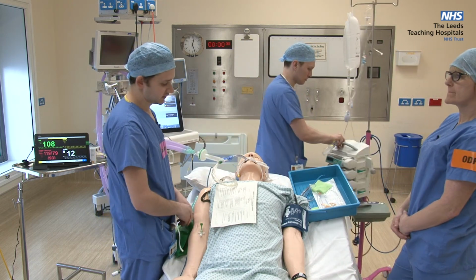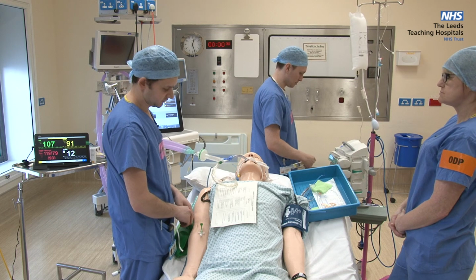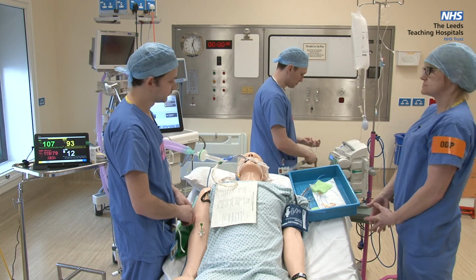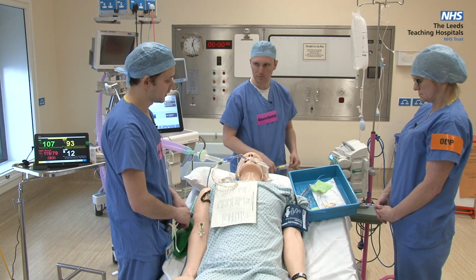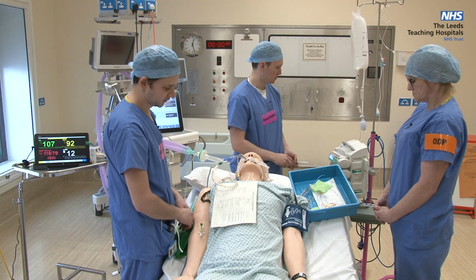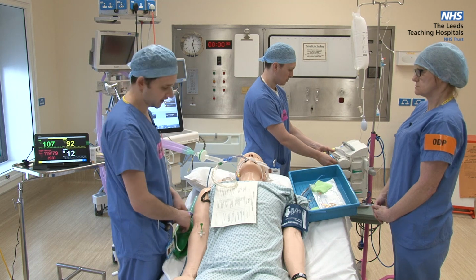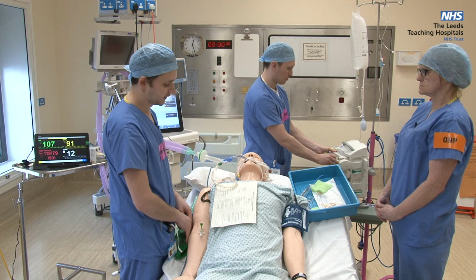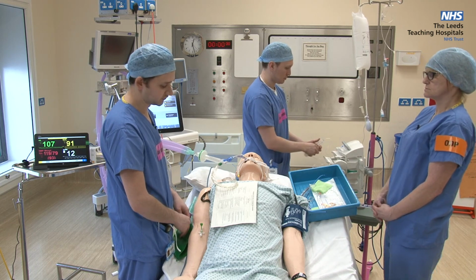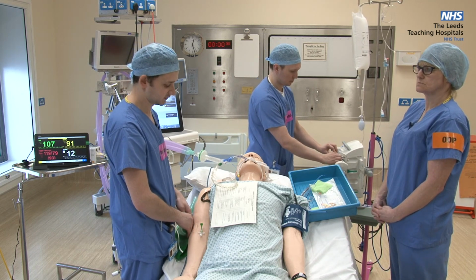At this point, we would insert an NG tube, consider invasive monitoring with arterial and central lines. We would make sure we've cleaned the video laryngoscope. We would dispose of any contaminated airway equipment. We would check our ventilator settings, and then we would leave the room and perform our doffing procedure, including buddy checking, and have a debrief.